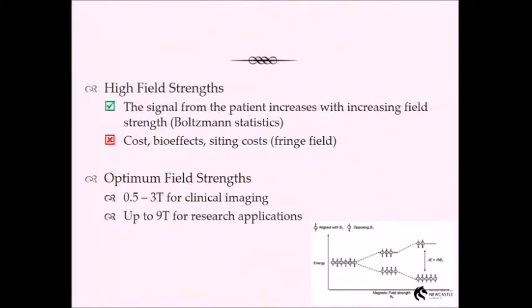People that react to the gadolinium contrast agent, if they get NSF, it basically kills their kidneys, and they're looking at having a renal transplant. So what I say today, that it's safe, may not be what I tell you next year. It is a changing field, but characteristically MR is considered very safe.